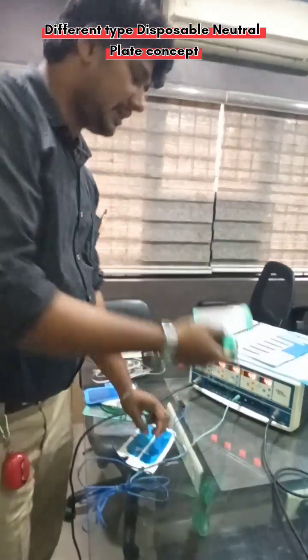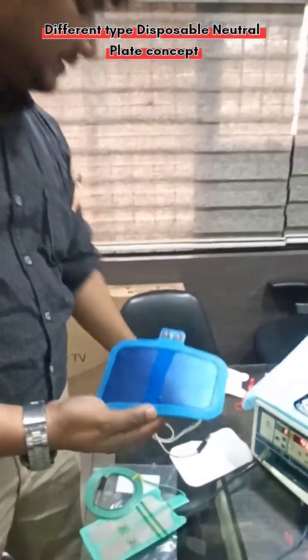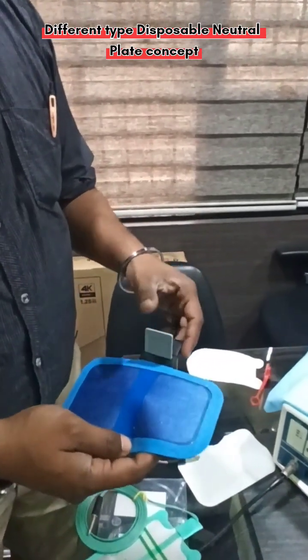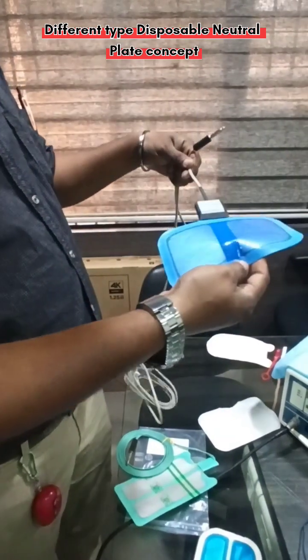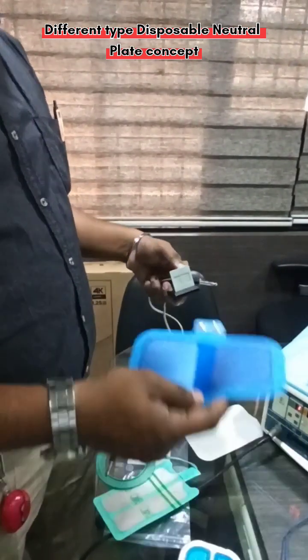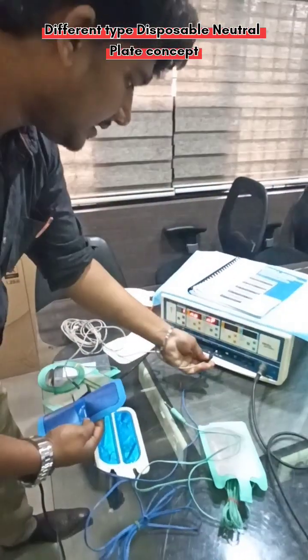With the split-type, there are different variants. This is another type with a separable cable — the cable can be detached. What you do is open the clip, put the plate in, and lock it. The advantage here is that this cable can be reused. For example, the plates come in a pack of five or ten. After each use, just open the clip and throw away the used plate. No need to throw the cable — just reattach a new plate and close the clip.